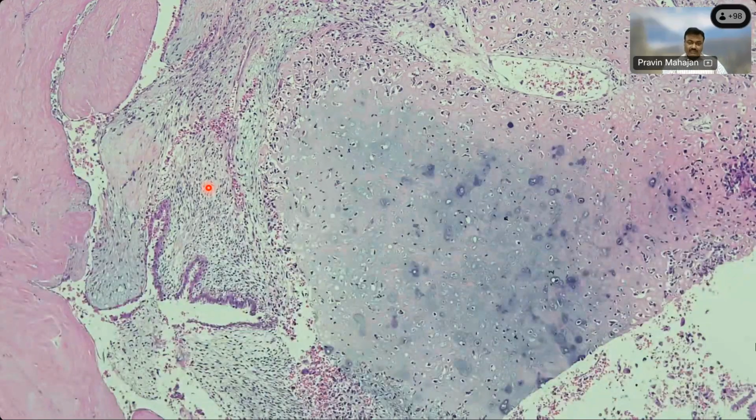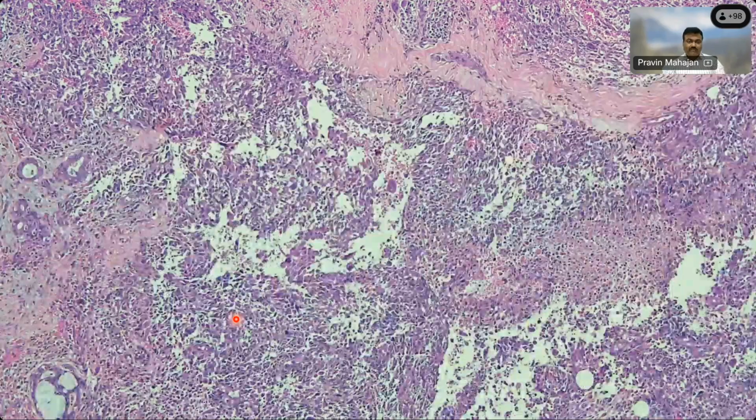And in some area there was this chondroid differentiation also. So phyllodes can show you chondroid, osteoid, angiosarcoma, anything. It can show liposarcoma. And that was the area. This was more undifferentiated areas, which was looking very high grade pleomorphic sarcomatoid, which showed some P63, some CK5/6, which led me to believe on just the core biopsy that I would favor carcinoma over a phyllodes, and that's what I had done. But mastectomy is showing a completely different picture.